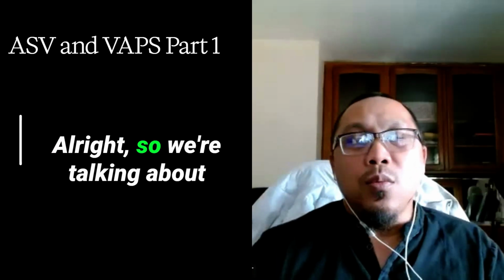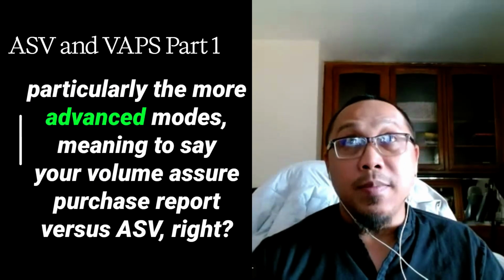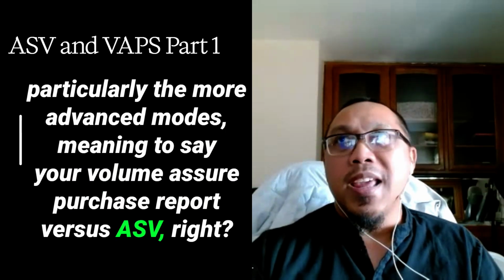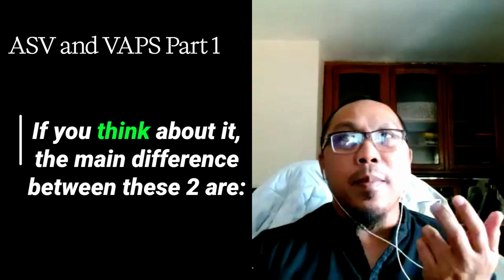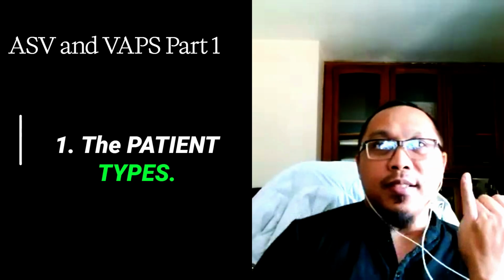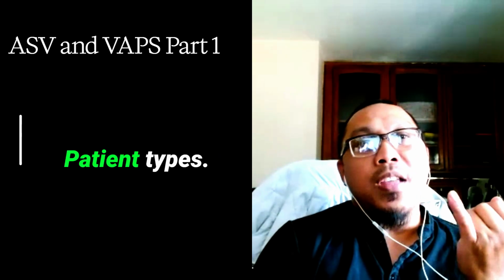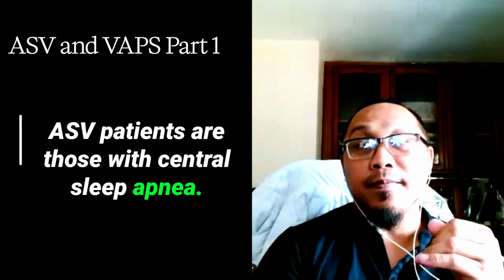All right. So we're talking about modes, particularly the more advanced modes, meaning to say your volume-assured pressure support (VAPS) versus ASV. Okay. So what are the differences? When you think about it, the main difference between these two is, one, the patient types. Why? ASV patients are those with central sleep apnea.